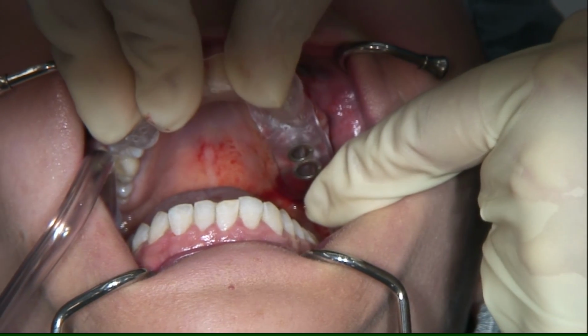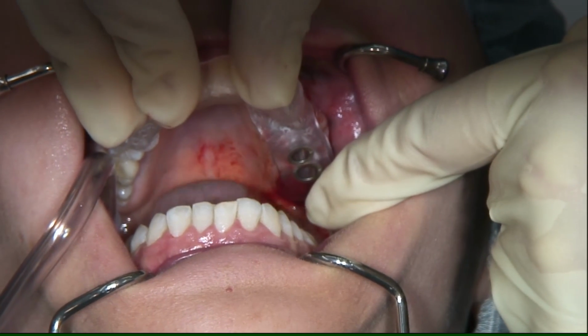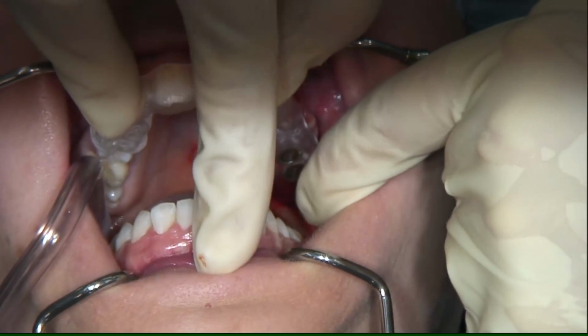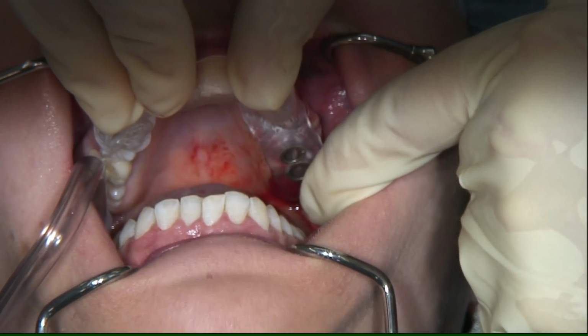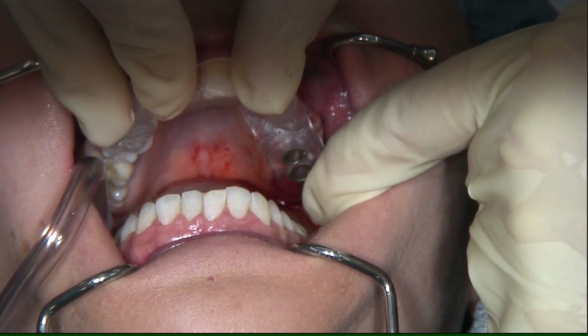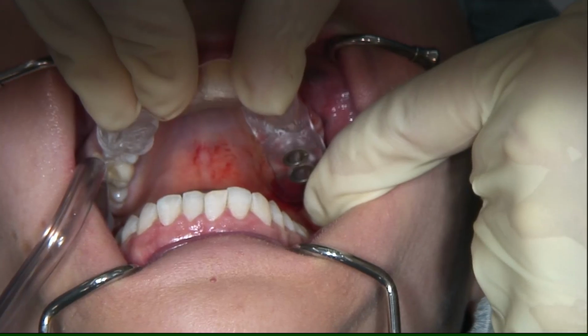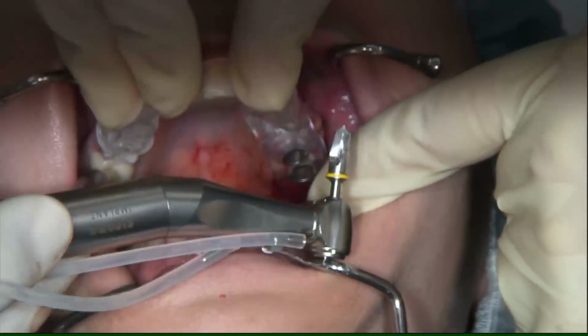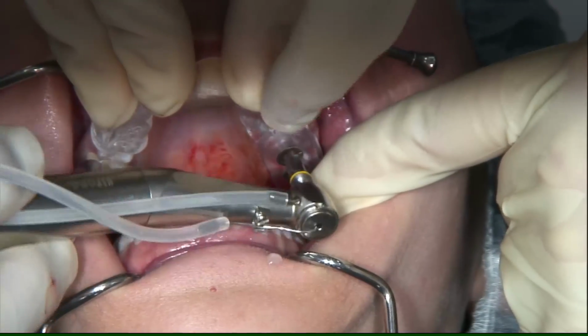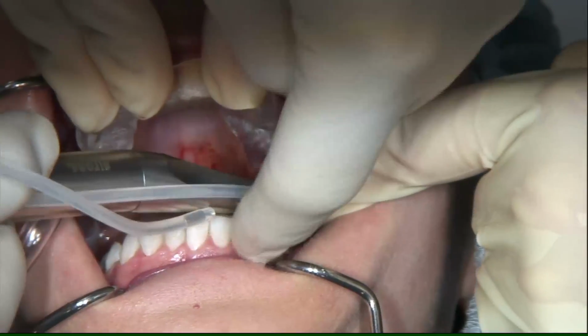And the planning of the implant surgery is done intuitively before with a few clicks in advance to plan precisely the exact position, angle and depth of the implants. And here you see the first drill. We are starting, or we want to place Xive implants.